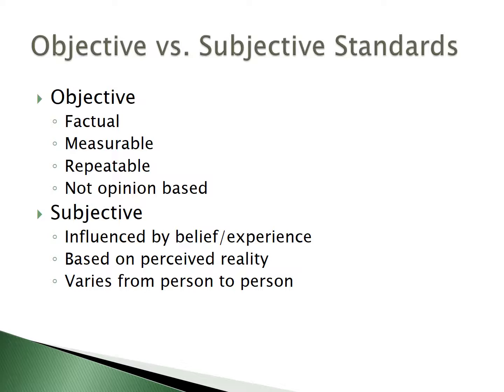So with ultrasound, you might have people that like to image at different brightnesses. We talk about, well, I'm kind of a dark imager versus a bright person. Those are going to be subjective standards, like, well, I think the machine is doing fine because I like dark, where somebody else might say, hey, I think the machine's broken, it's imaging really dark. Those are subjective because it's going to vary from person to person.